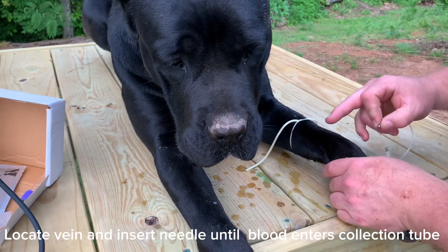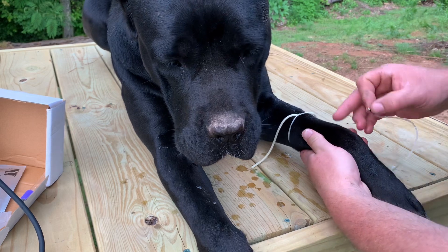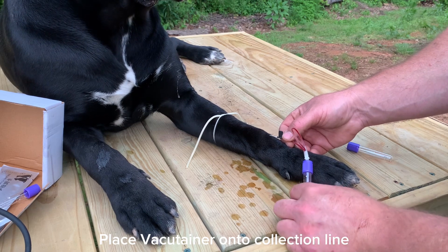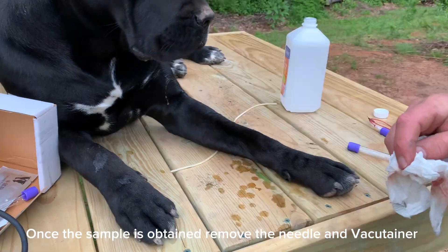Locate vein and insert needle into vein. Place vacutainer onto collection line. Once the sample is obtained, remove the needle and vacutainer.